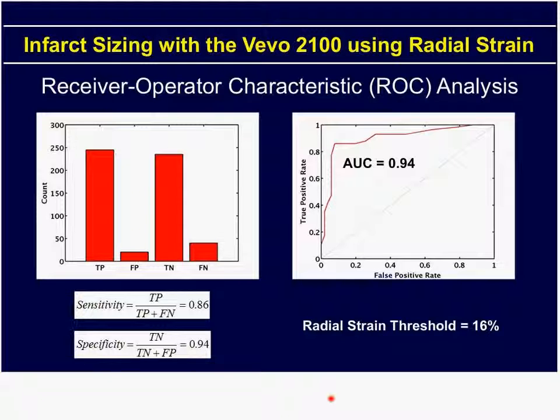I might add that the motor stage is more convenient. The stage upon which the mouse sits has a micrometer built into it, and if one aligns the mouse properly on that stage, you can use that micrometer to advance the stage in half-millimeter increments, and you can achieve the same short-axis stack, just as you would in MRI.